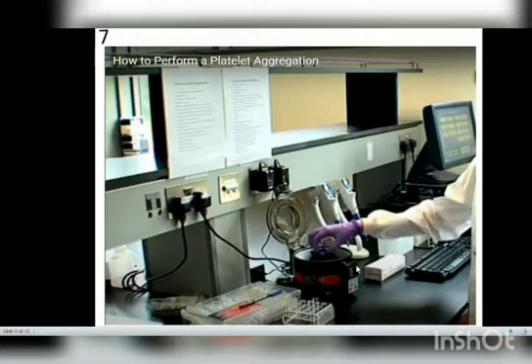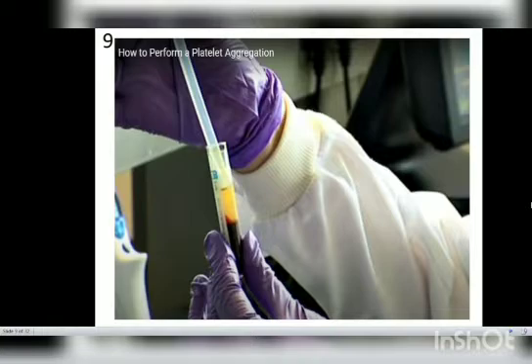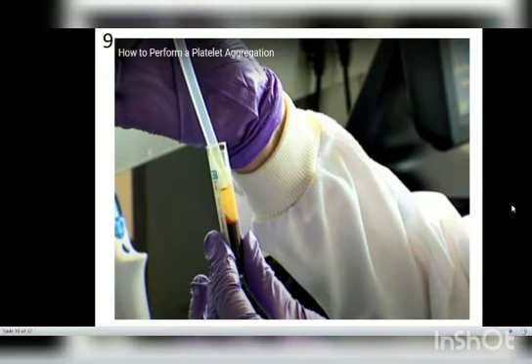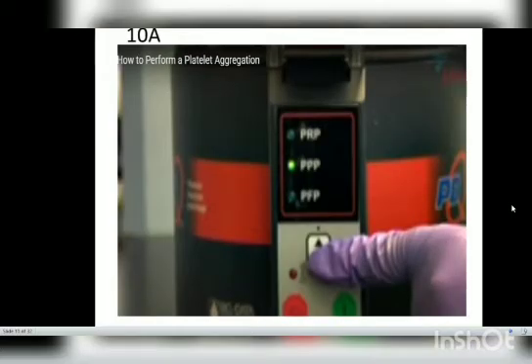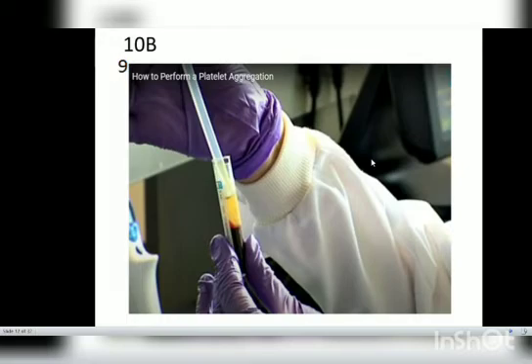Close the lid and select the PRP setting. When the centrifuge has finished spinning the lid will open and you take out the tubes, which have been separated into red cells and plasma layers. Aspirate the PRP — which contains platelets in suspension and appears cloudy — into the tube labeled PRP. Replace the vacutainer tubes back into the centrifuge, select the PPP setting, and start the centrifuge. After two minutes the centrifuge will open; the platelets have been removed and the platelet-poor plasma is now quite clear.